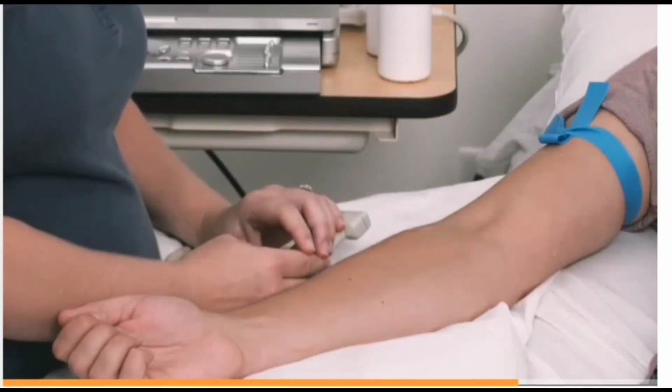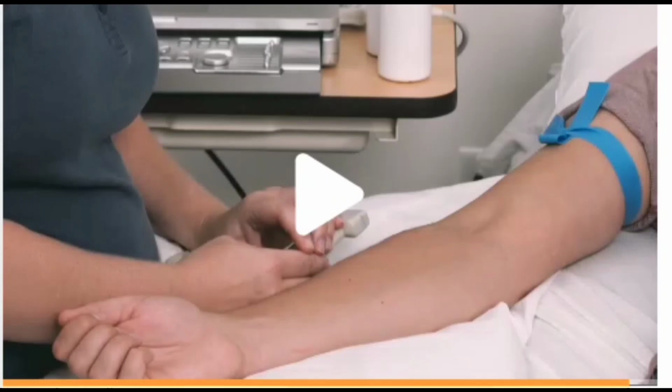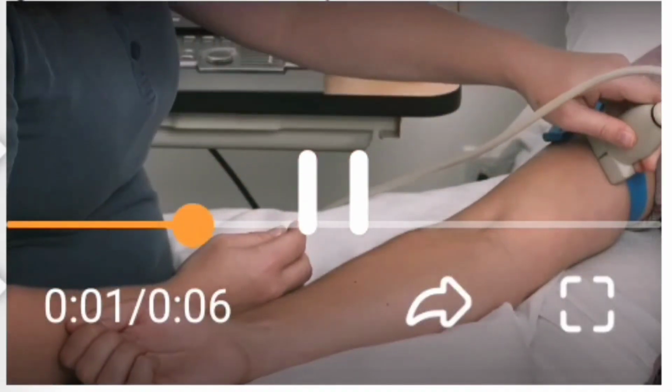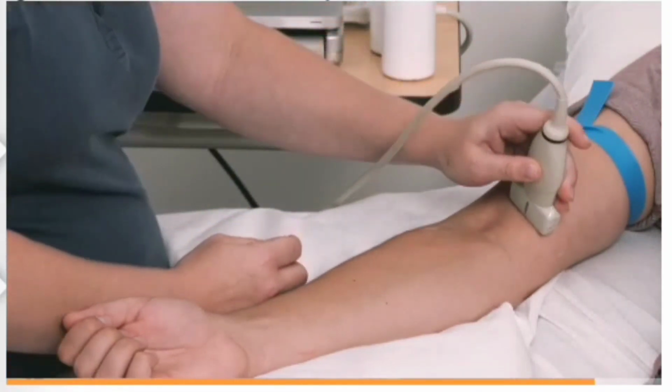During this time, check for flow-limiting central venous stenosis. Then repeat the screening for the basilic vein in the proximal, mid, and distal portions of the upper arm.